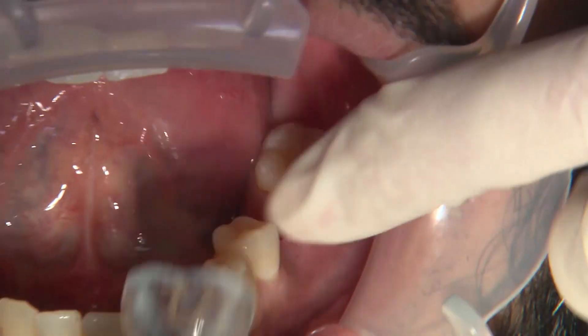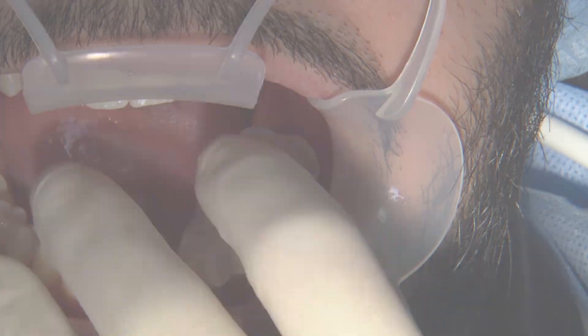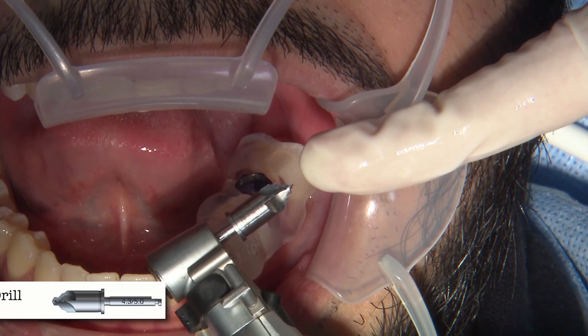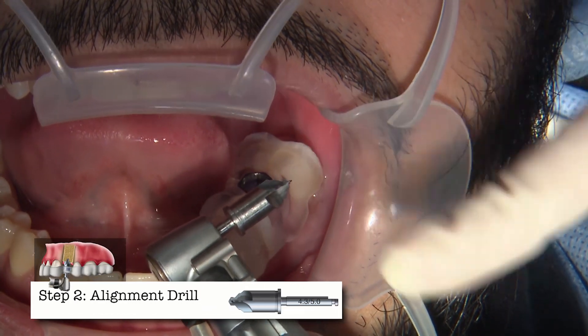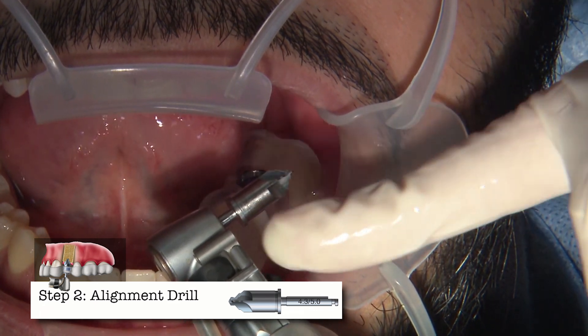Put the guide back in and we're going to go through our sequence. The really nice part about the Han implant drill kit — I've used a couple of different kits — is especially with any guided surgery kit, the drills bottom out.